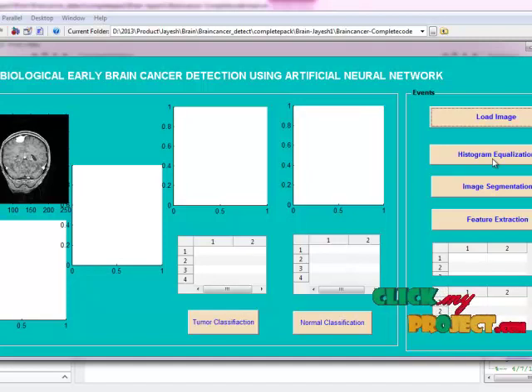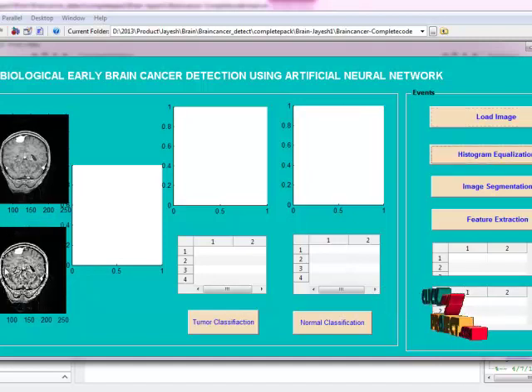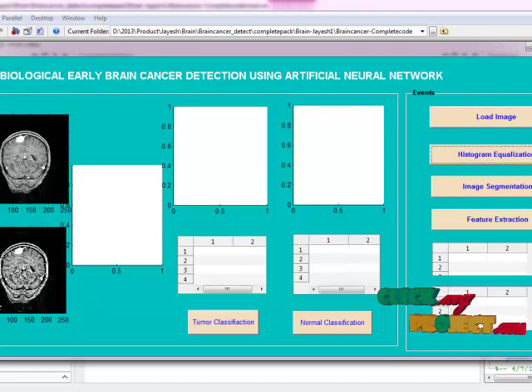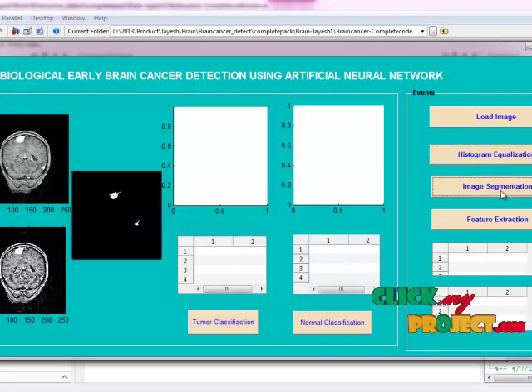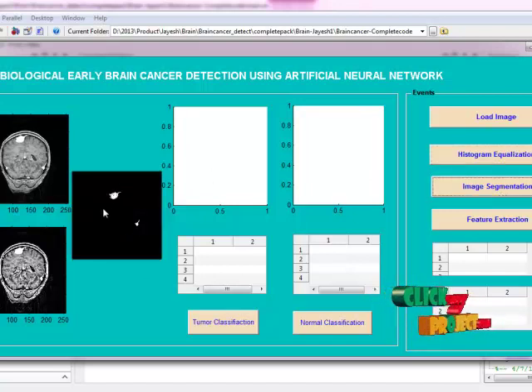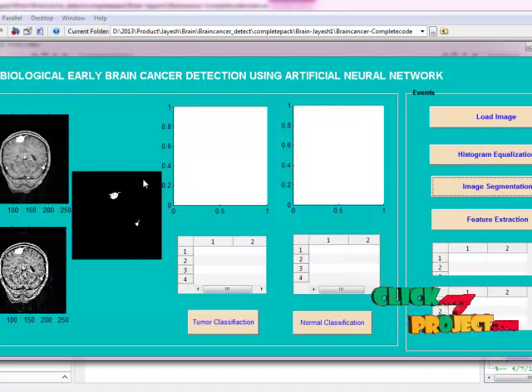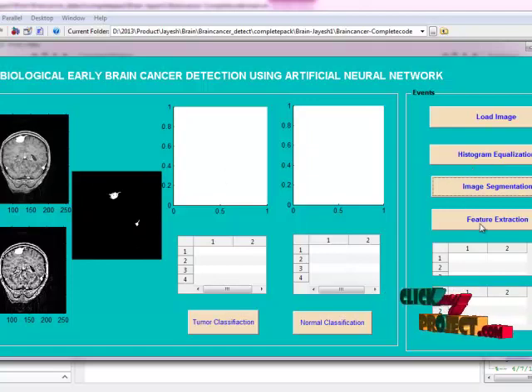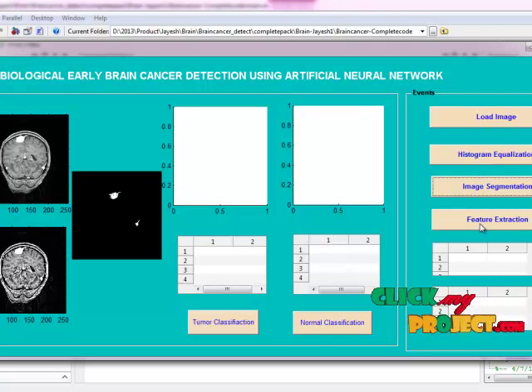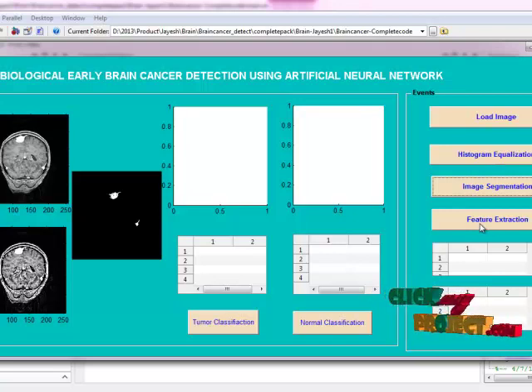Histogram equalization is applied to our input image for enhancement. Then we segment the tumor part with the help of the global thresholding algorithm. Here the tumor part is segmented and displayed in its particular place. Then features are extracted from our input image using GLCM.